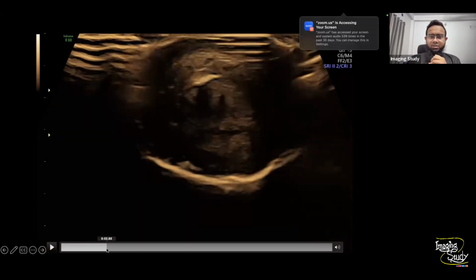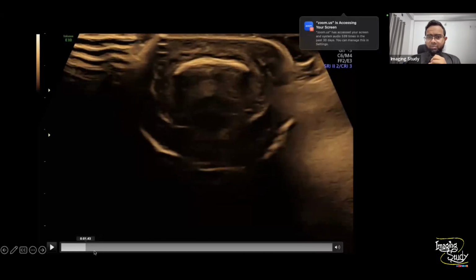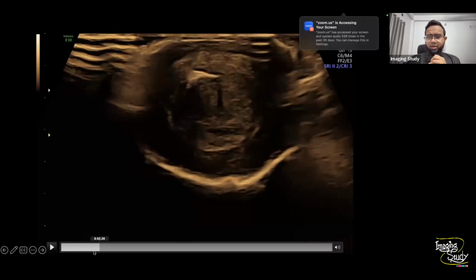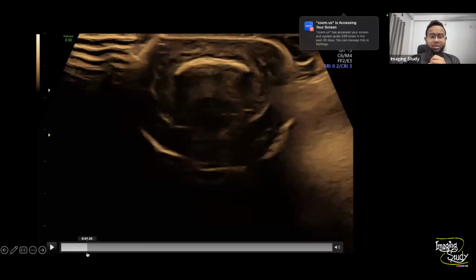You see, this is the first one. This goes to another one. It may be interconnected because before finishing one, you are getting another one. So these are the calcified plaques. Now the problem arises whenever you see this type of calcified plaque at the dorsal aspect.